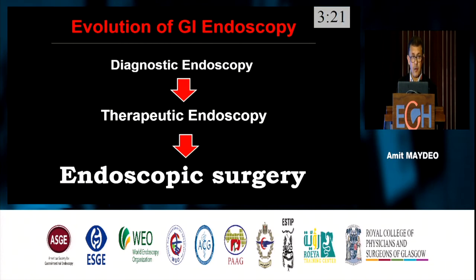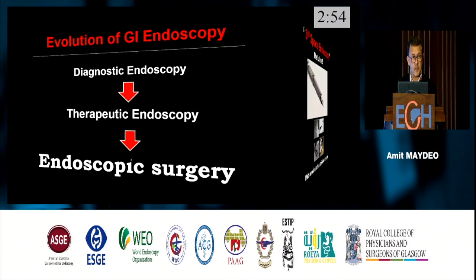So therefore, friends, ladies and gentlemen, diagnostic endoscopy has evolved to therapeutic endoscopy, but the time has come for us to enter into a completely new field, and that is flexible endoscopic surgery. So whether you are a gastroenterologist or an endoscopic surgeon, there is a new field which is going to evolve in the future. It is high time those of you who want to do advanced intervention start adapting to it, and that is flexible endoscopic surgery.